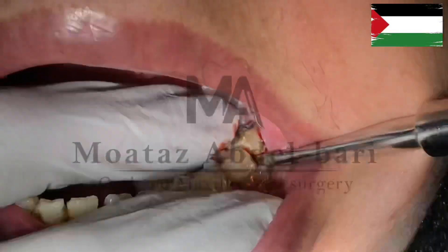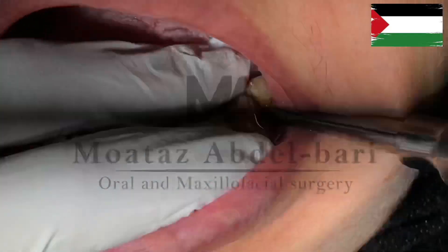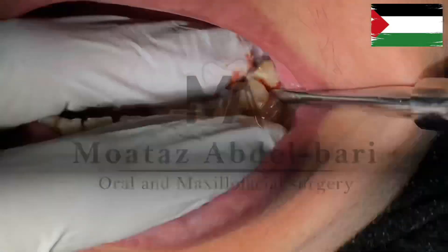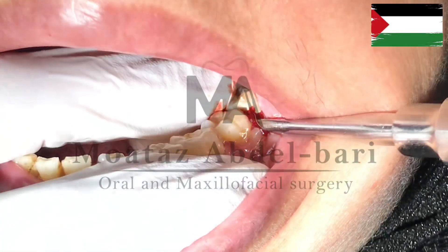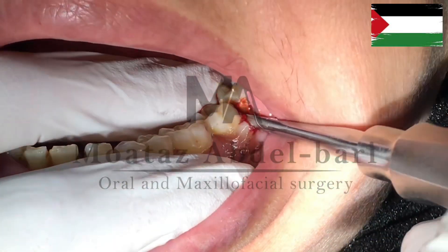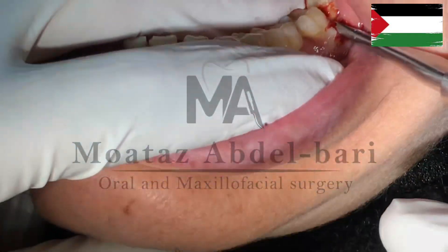As you proceed, you will observe the elevation if there is no distal lock distal to the lower third molar being extracted. Continue the movement, feeling for relaxation and leverage, and pay attention to stop if you feel any resistance until the tooth is fully extracted.